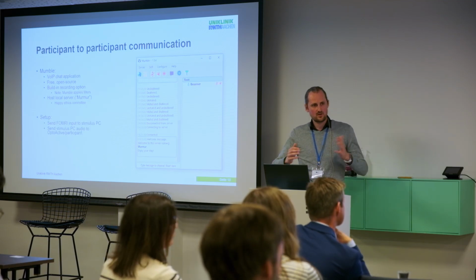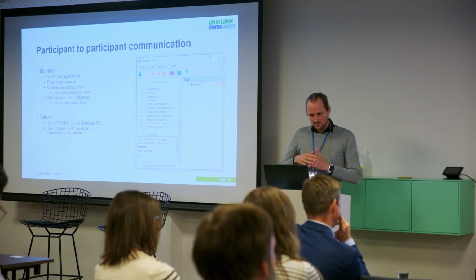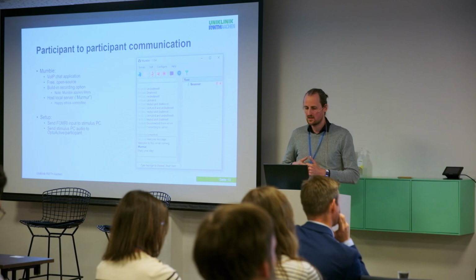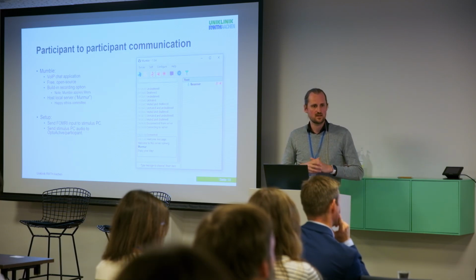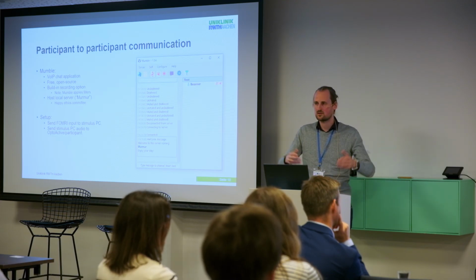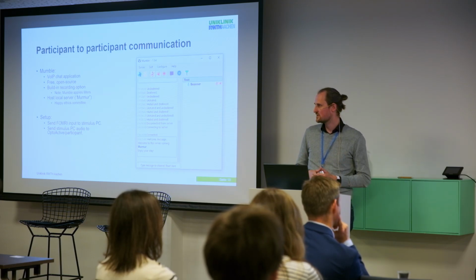So, for our setup, we took our microphone in the fMRI, and this was sent to the stimulus PC, simply by USB connection, and the stimulus PC audio was fed to the participant. And because we do that on both scanners, it's no different than when you're chatting with one of your colleagues through Zoom or Microsoft Teams. In this case, the participants just happen to use Mumble, and they happen to be undergoing MRI scanning.